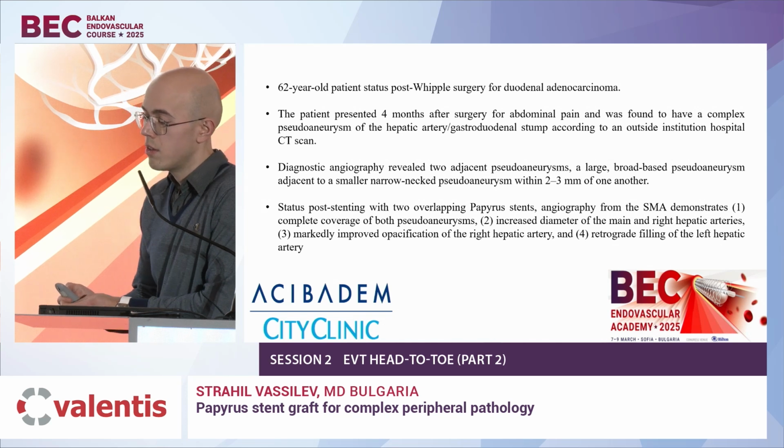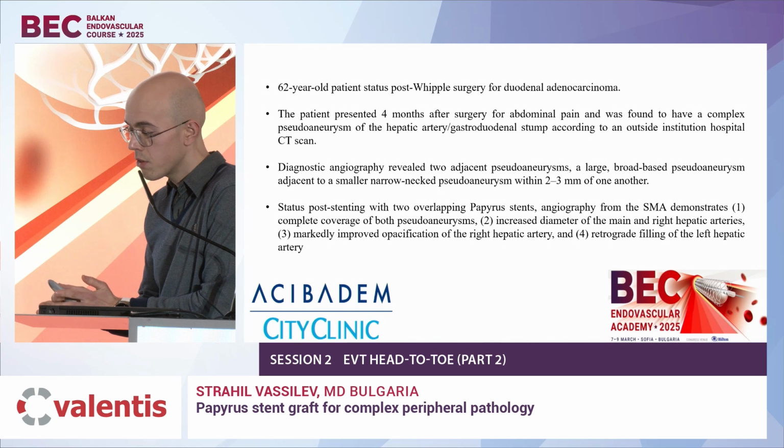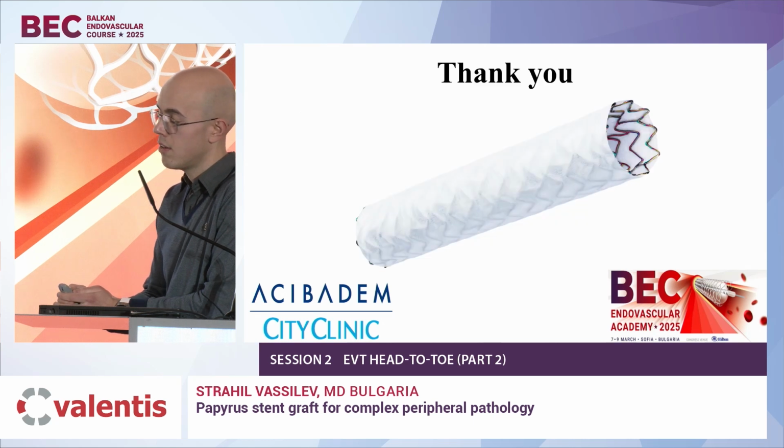So we did stenting with 2 overlapping Papyrus stents, which demonstrated complete coverage of both aneurysms, increased diameter of the hepatic artery, and markedly improved opacification and, of course, blood flow in it. So that's it. Thank you.